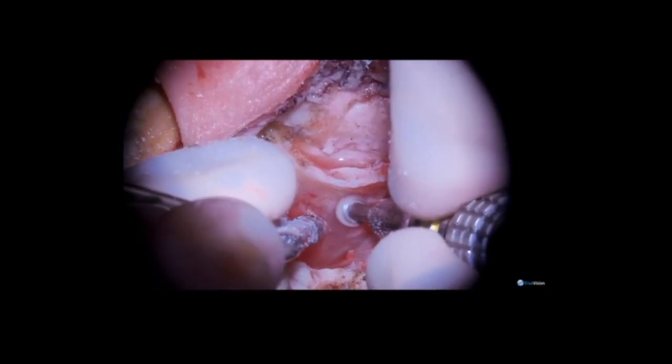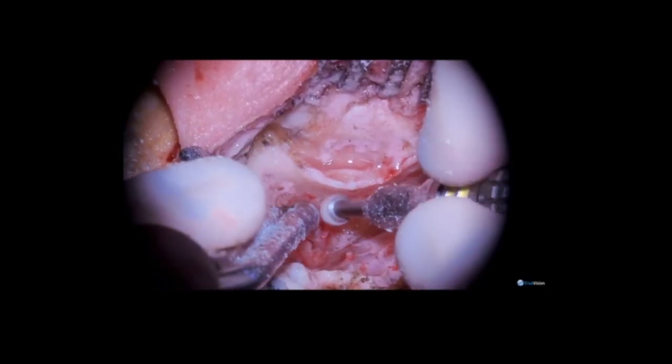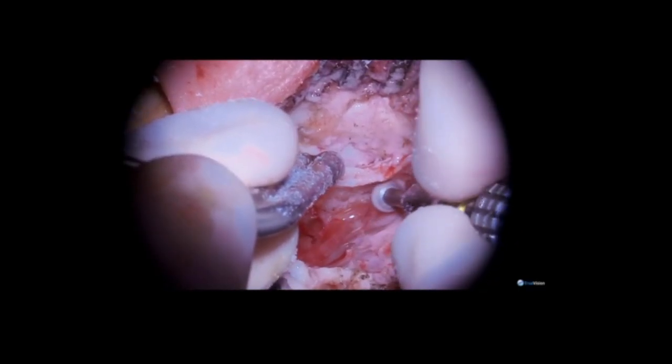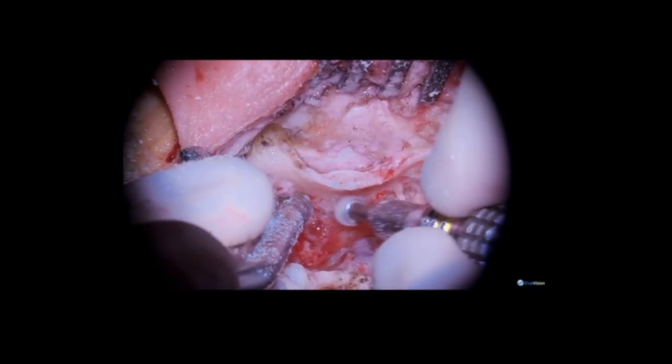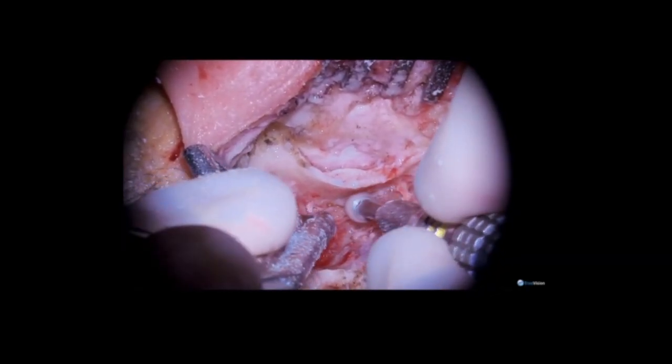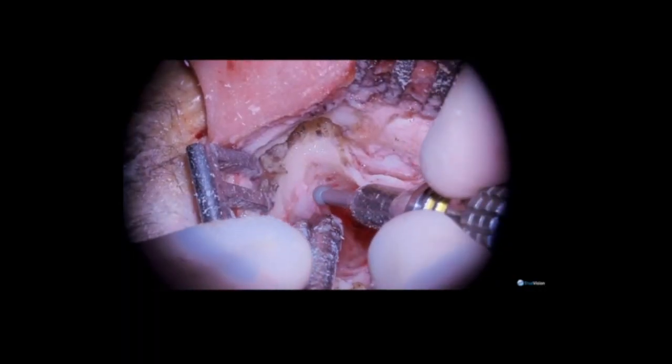Thinning the external auditory canal wall is extremely important in achieving a good posterior tympanotomy, the first step there being to open up the inferior air cell tract down towards the mastoid tip.